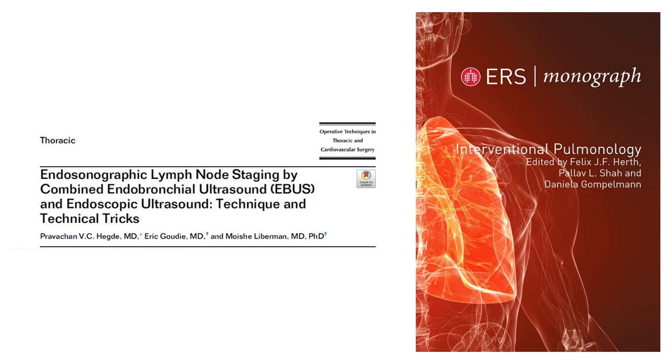One thing I would screen for before you attempt EUS, just from history, is a history of dysphagia or a history of esophageal dilatation. If there is a stricture, try to avoid it. And then also history of varices. If they have had a varix, try to avoid it. But sometimes you coincidentally diagnose varices when you go through the esophagus with an ultrasound probe as well. And if you see that, try avoiding puncturing through it, and don't do it via the EUS.